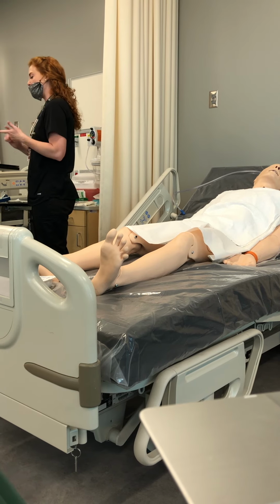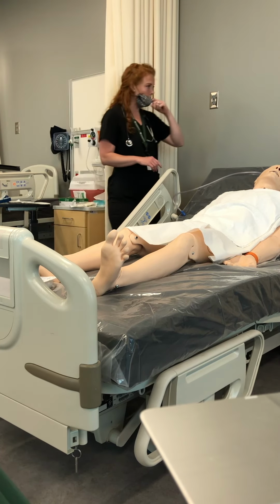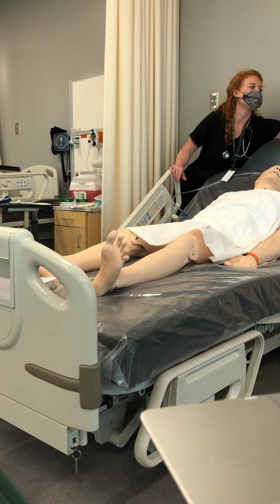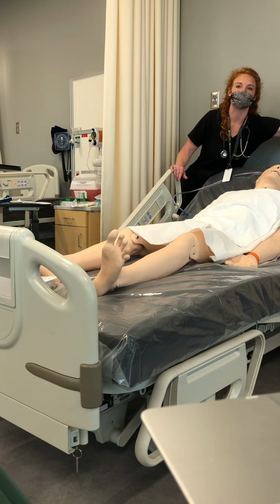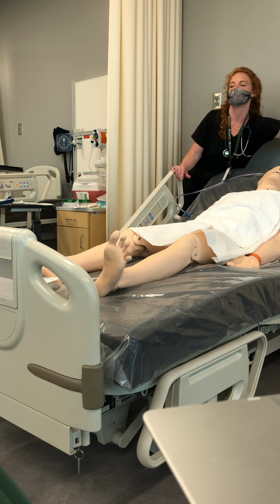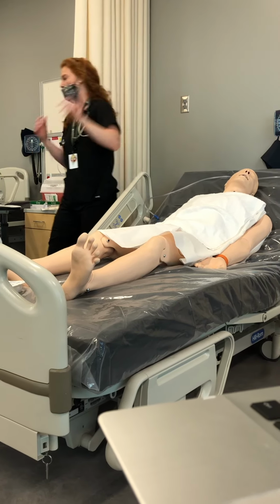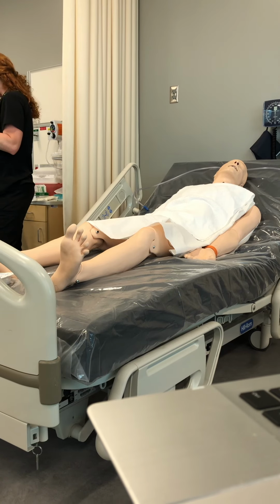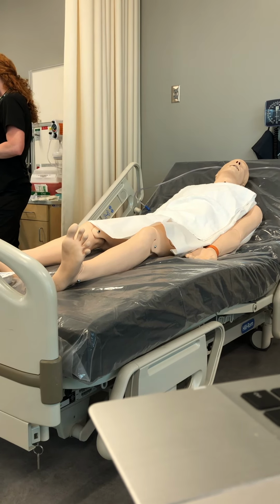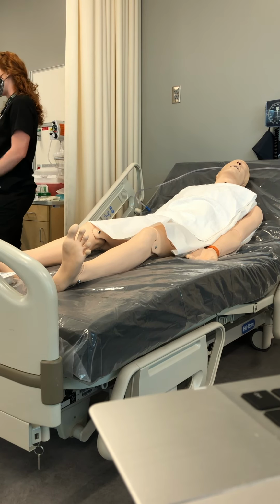So first thing is to increase supplemental oxygen prior to, we don't actually have them hooked up on oxygen, so you can either verbalize that you would or turn this knob. We don't actually have oxygen going through here, so as long as I see that you're adjusting the oxygen in some way, I'm good with it. Or you can verbalize that you would do it and not even worry about it, but it's not actually on. If the patient is on a ventilator or a trach dome, then just make sure that they're connected at all times.